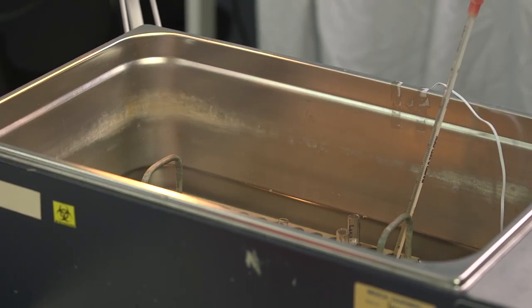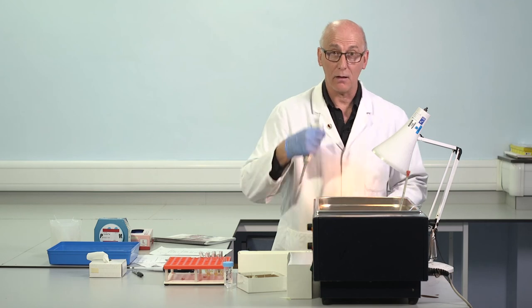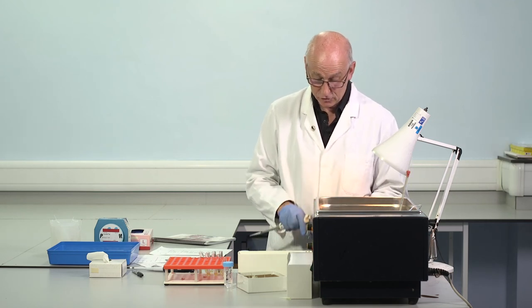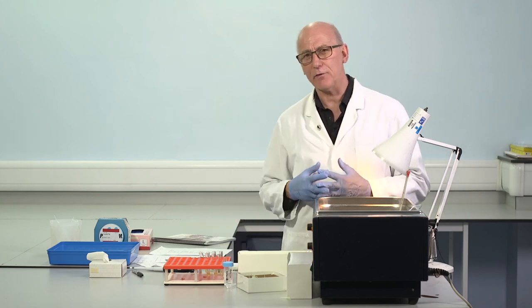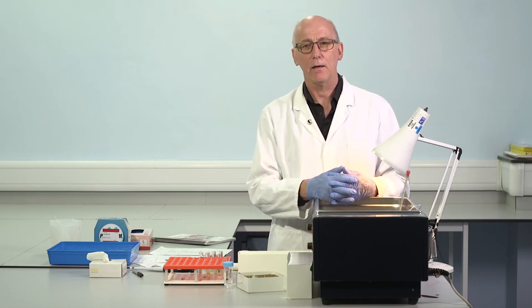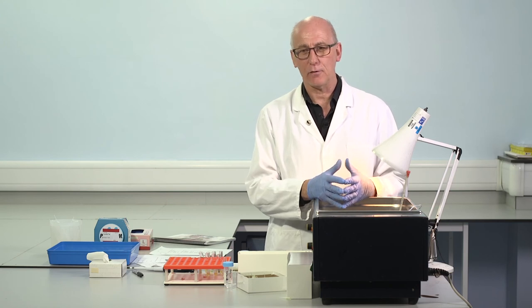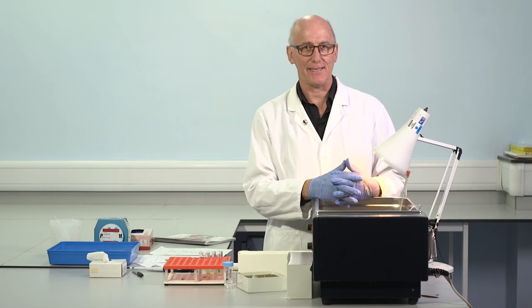In particular, any kind of artificial hemolysis of the sample, anything that's occurred during collection and processing, even very minor levels of hemolysis can impact on APTT, causing changes in both directions, sometimes false prolongation, but more frequently falsely shortened APTTs.